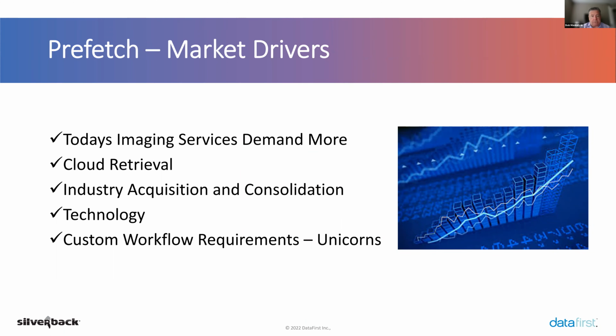One of them that was unexpected was the onset of COVID. We had a lot of end user customers who were working from home, and the ability to move exams around and get them to the right place just in time is a significant driver in using prefetch.